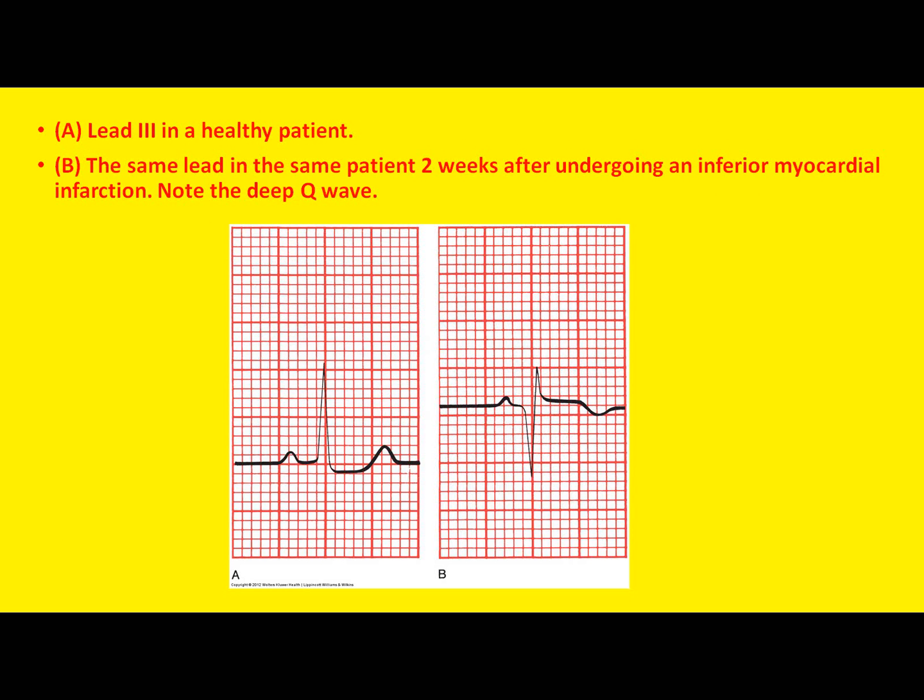Here's a normal patient, and this is after the heart attack. You see how the Q wave now? No Q wave before. Same patient, no Q wave, but now there's a Q wave.